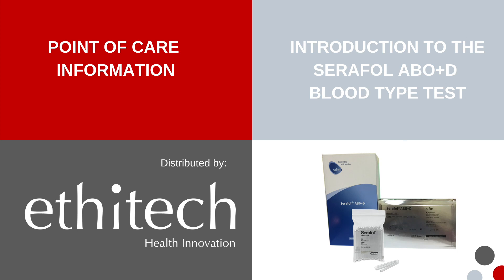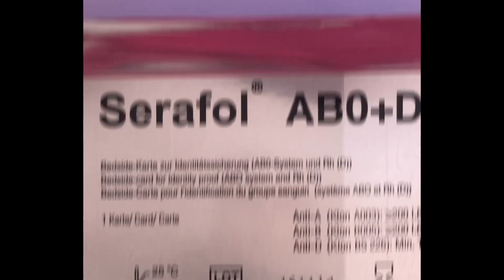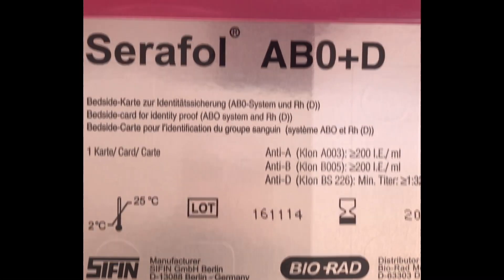Introducing the Serafol ABO Plus D blood type test. Open the foil wrapper and take out the testing card.